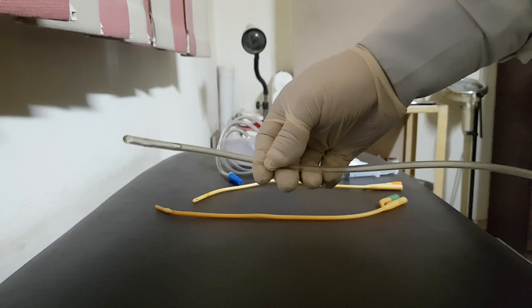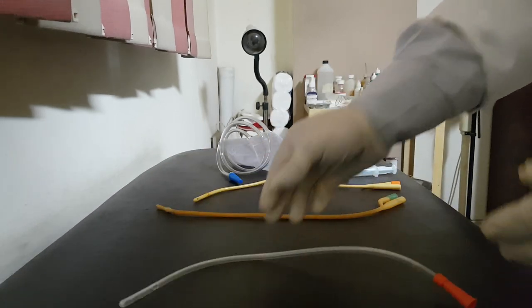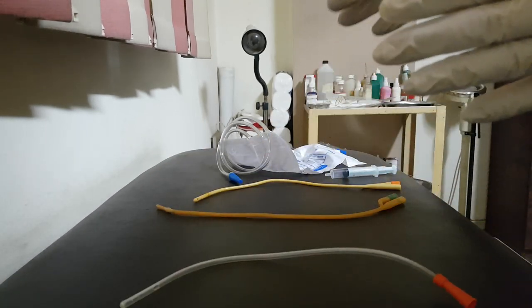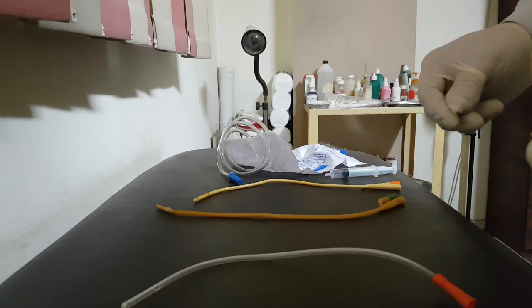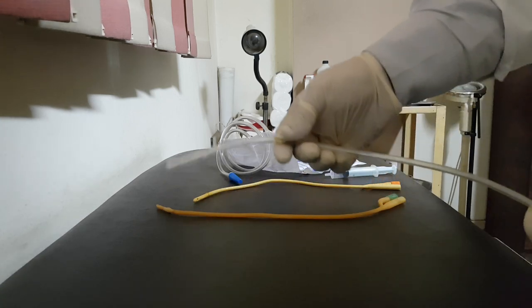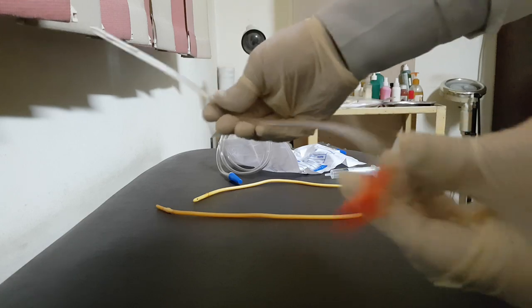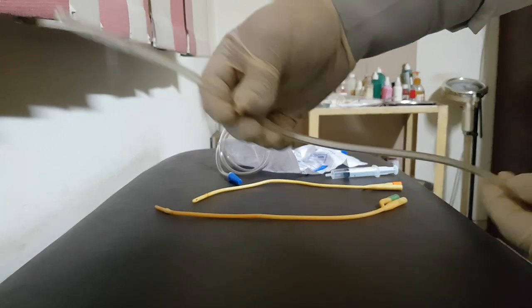So we have two types of catheters: intermittent catheter and indwelling catheter. One example of the intermittent catheter is this one, it's called Nelaton catheter.